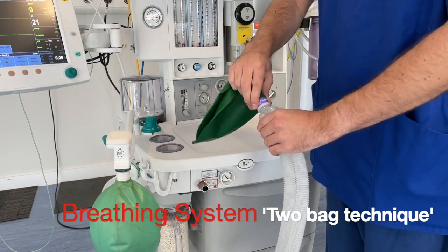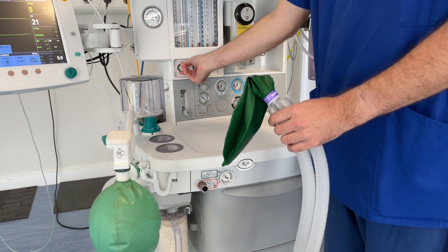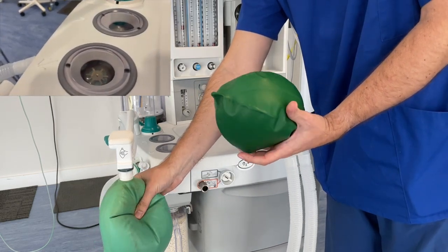Attach a test lung or bag to the patient end of the breathing system. Set the fresh gas flow to 5 litres per minute and manually ventilate, checking the function of the unidirectional valves.